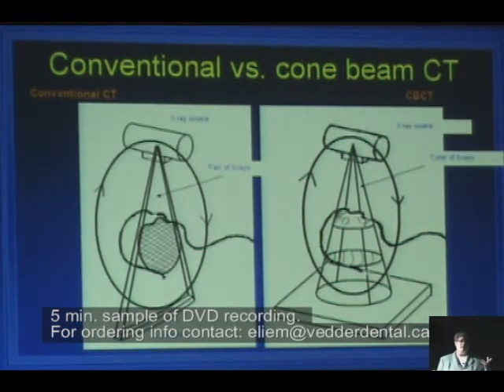So a lot of you may or maybe may not be familiar with medical CT units. Some of you may have had a CT scan done in a hospital. Generally speaking, on those scans, the X-ray beam is very, very narrow from front to back. The patient is lying on a table, and the beam is wider at the bottom than it is at the source. And this is called a fan beam. Not the kind of fan that cools you, but the lady's fan, okay? So it is very narrow from front to back. So if we're interested in imaging the entire head, the beam is narrower than the head. So what do we have to do? We have to take multiple images of the head. And that's what actually happens. The beam will spin around the patient really fast, and the table moves as it's spinning. So we slowly, eventually, image the entire head, usually from top to bottom.